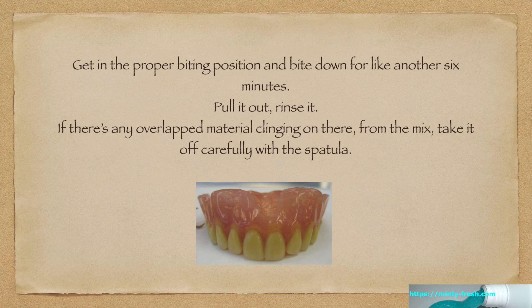Get in the proper biting position and bite down for like another six minutes. Then pull it out and rinse it. If there's any overlapped material clinging on there from the mix, take it off carefully with the spatula.